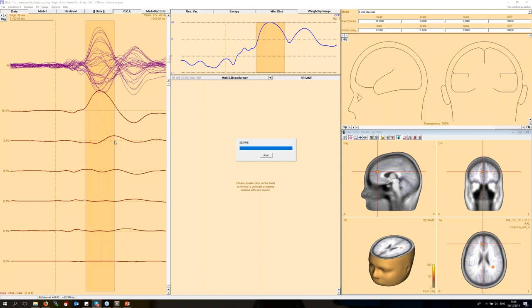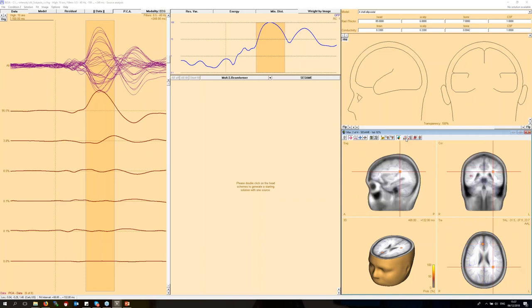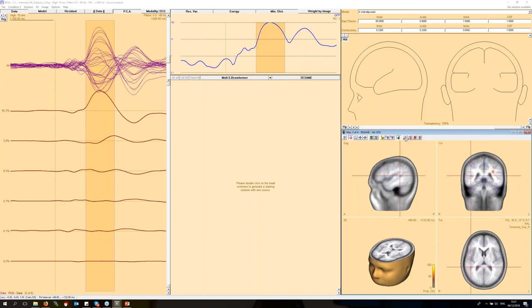Okay, so now it's converged to the final result, and we can see this anterior cortex, anterior cingulate, is active here, and again, we have the lateralized areas. This is close to the auditory or insular region, and this is close to the auditory on the other side. The locations are not super precise, but the activity will be recovered very well using this. If I now introduce sources, I also get a very good idea about how many sources I do expect and roughly where they are located.